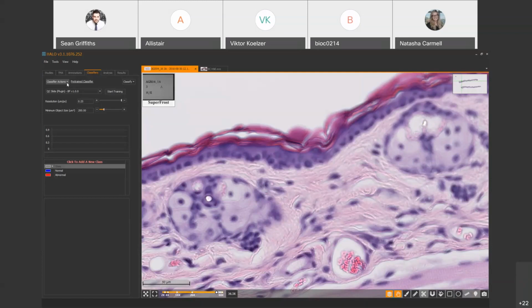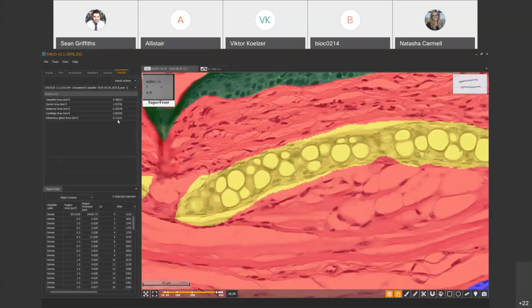So the output of the models is going to be quite consistent. You're going to get the same markup, the same training decline here, or cross-entropy decline. Output, I guess, would be area-based, object-level data. But you get the advantages, of course, of using all of the tools within the software to make the training regions, which would probably be quicker than if you didn't have the easy-to-access GUI. So I don't think there's a big change in the outputs or output visualization.